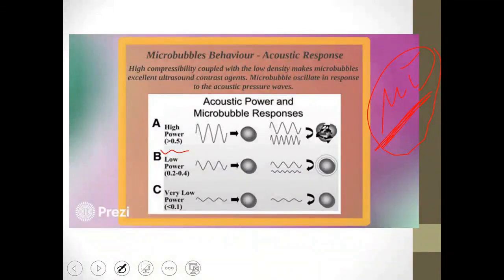If you increase this mechanical index beyond a certain range or value, it could lead to rupture of the particles present. We will talk about this in the context of ultrasound safety. Tomorrow, God willing, it may not be a large amount, but it is based on the fact that, for example, you are using a specific method that allows you to do it without causing issues.